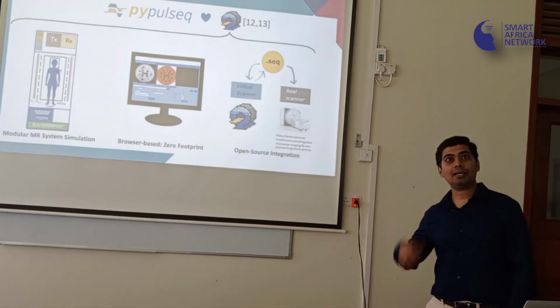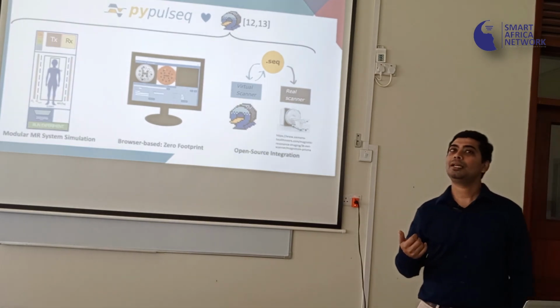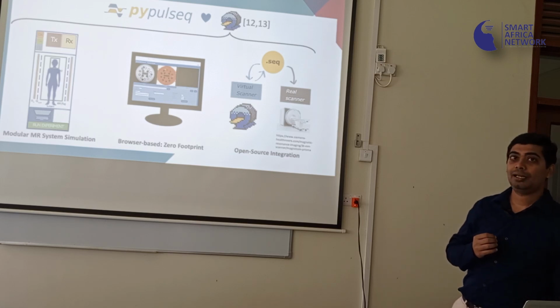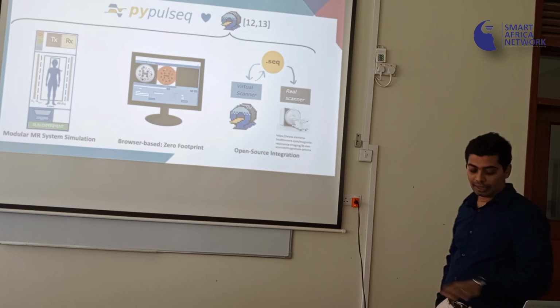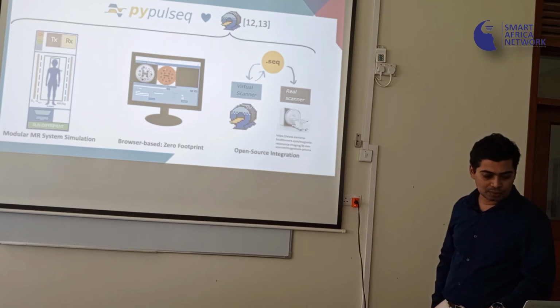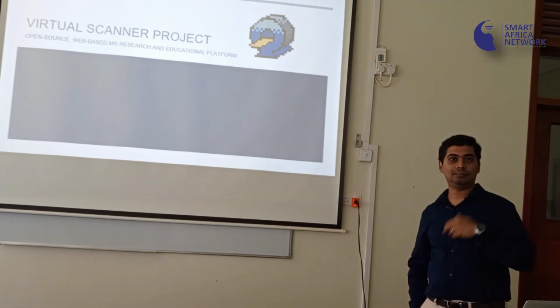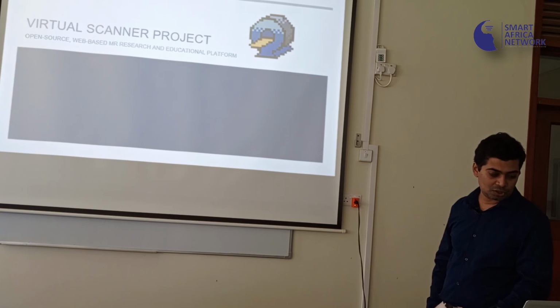In fact, this started out because Jonas put out a challenge at ISMRM to build a tool for education and research at the same time. So we started this, and this has been going on since 2019. This is called the Virtual Scanner Project. It's open source, it's web-based, and supports education and research.